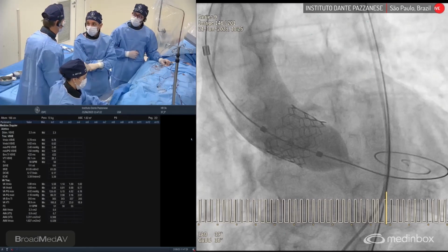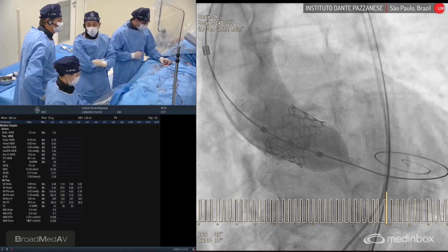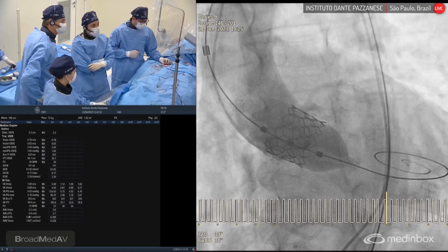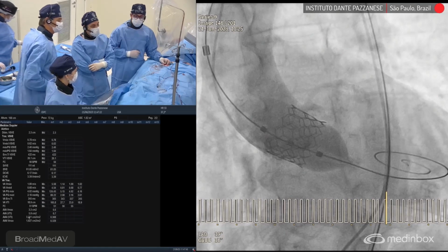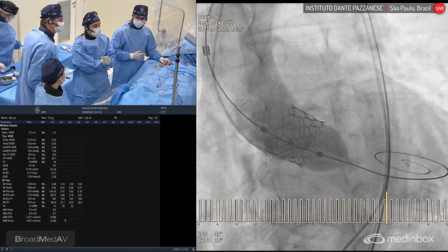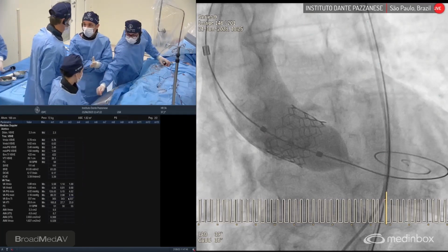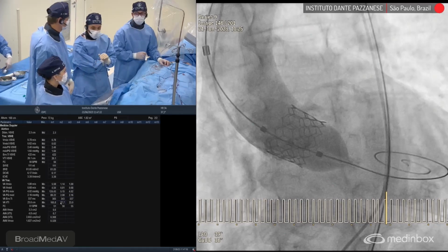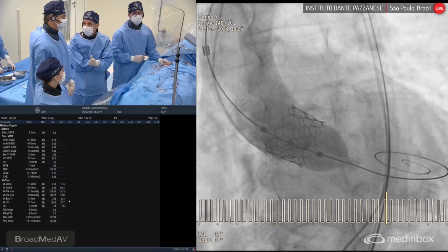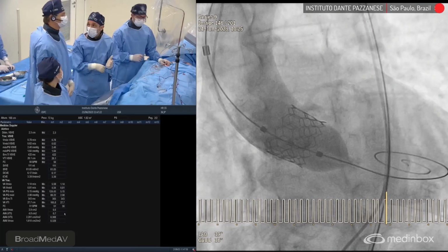So in bicuspid situations, Dimitri, how about if you have a low left coronary takeoff? You have to balance the risk of coronary occlusion, and it's also important to measure the sinotubular junction, not to prevent complications during the procedure, but when you think about durability and the possibility that this patient is going to need a second TAVI in the future.